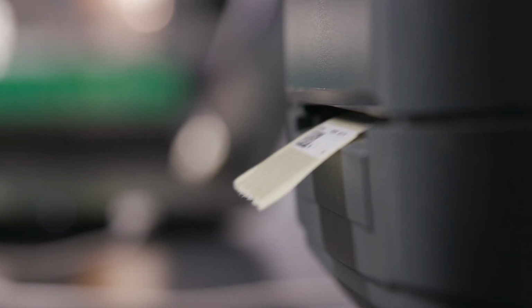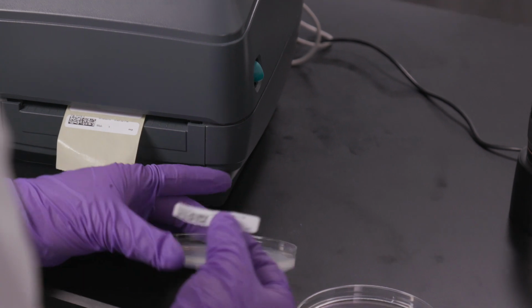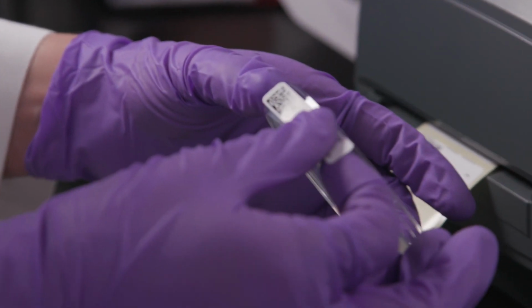After it's done plating, it will print a label with the name of the clinic, sample number, barcode, and the date and time the sample was plated. This allows us to trace samples from the time they come into our lab until the results reach the customer. Well, I imagine that type of traceability is important when processing a lot of samples. What is the barcode used for?